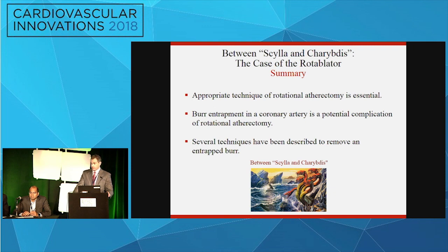You're absolutely right. What we were thinking is that after we did all the manipulation of ballooning and whatnot, we wanted to re-roto and see if we could loosen something up, so we pulled that wire back because of that. But before the final successful pull, that would have given you access to avoid ruptures. Yeah, absolutely. That's a good point.